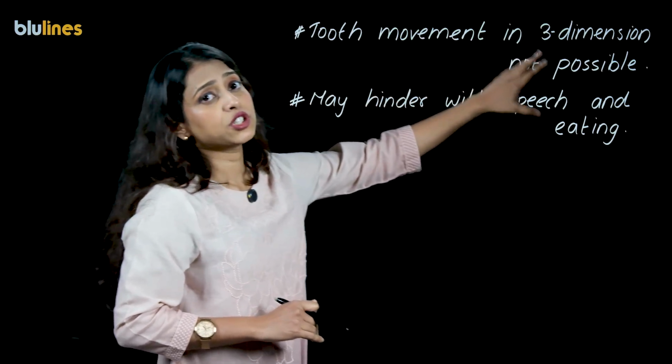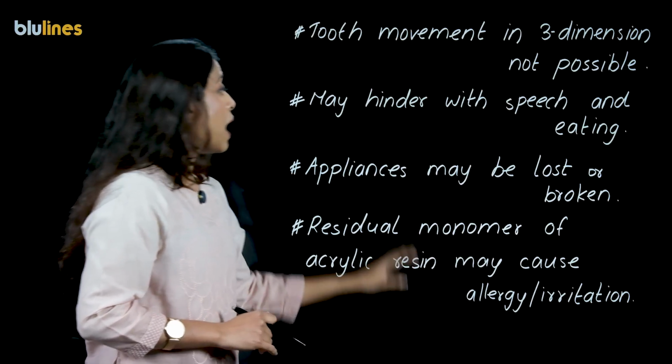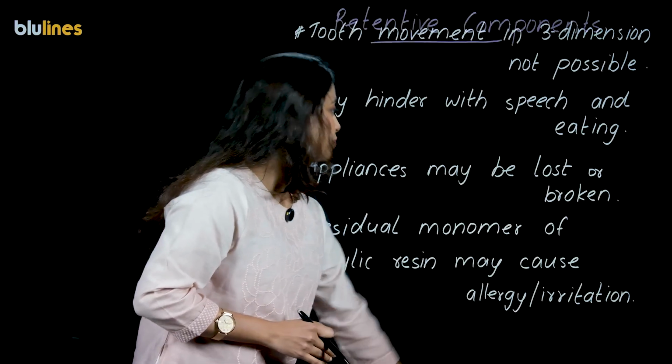Tooth movement in three dimensions is not possible. May hinder speech and eating. Appliances may be lost or broken. Residual monomer of the acrylic resin may cause allergy or irritation.